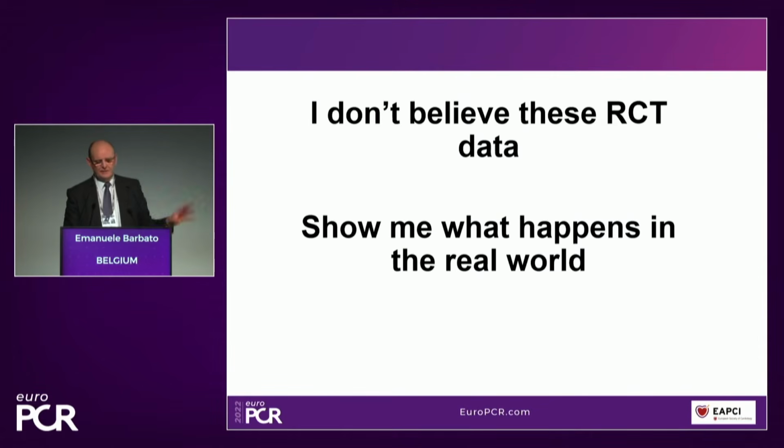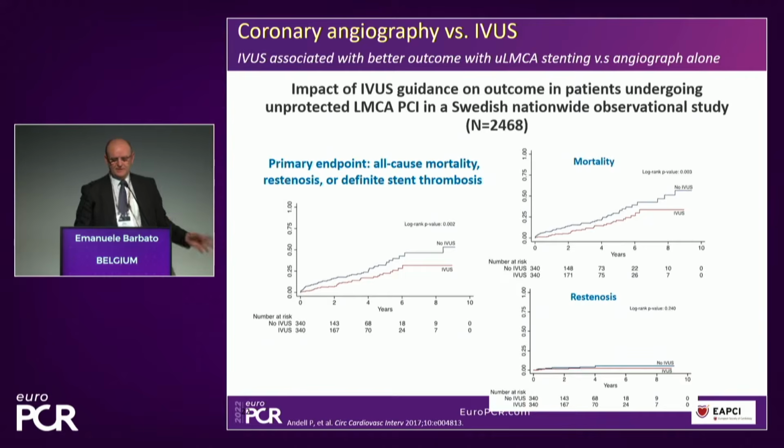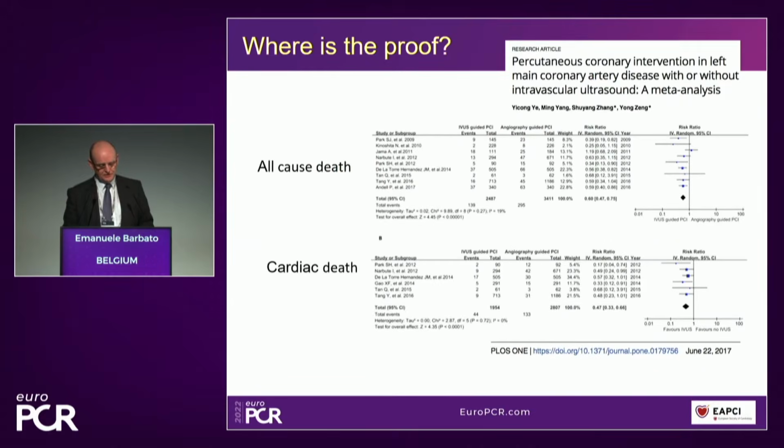But for those skeptics out there about randomized trials, I don't believe in randomized trials. Show me what happens in the real world. Show me what's happening in Oxford today. Well, this is what was happening in Sweden. Registry data from their excellent registry in Sweden looking at the impact of intravascular ultrasound on left main intervention, and you see an impact on mortality. Patients living longer and better when IVUS is used.